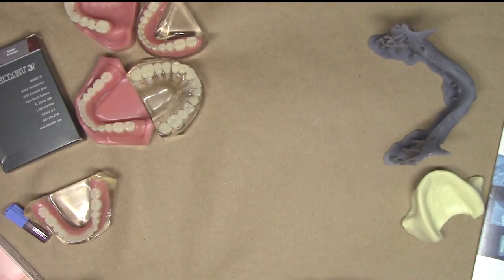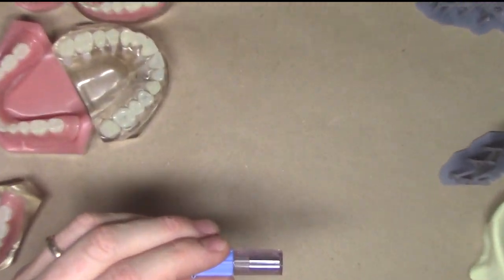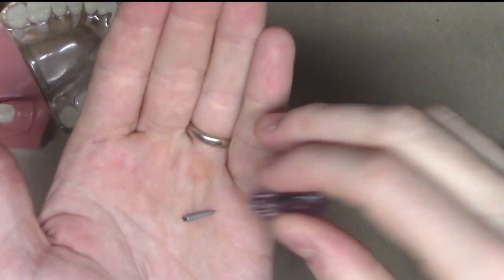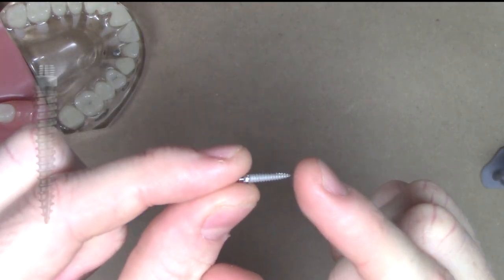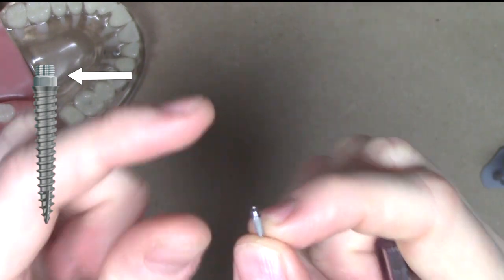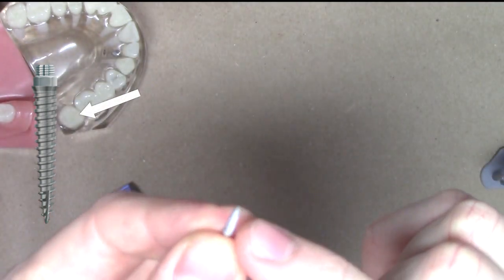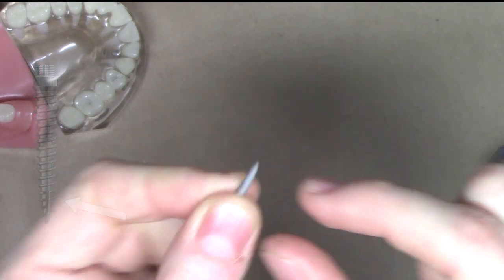When we start looking at some of the different features of what's available with what you would see between either a standard versus a narrow diameter implant, as I open up this packaging for a Zest Anchors LODI implant, you'll see here that this does have that design profile like I just mentioned. It has this external connection, as well as a progressively shaped thread design and a very apically aggressive cutting surface.